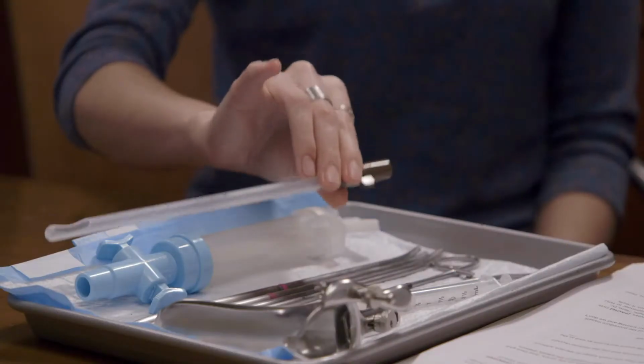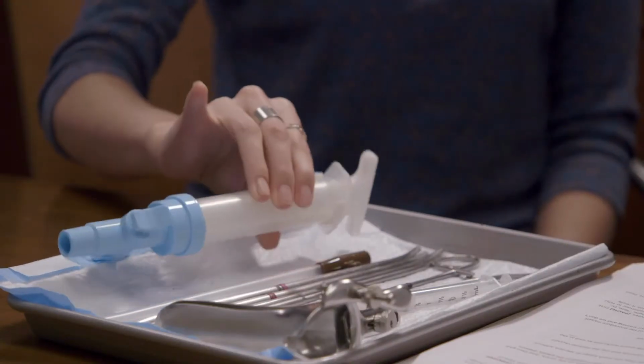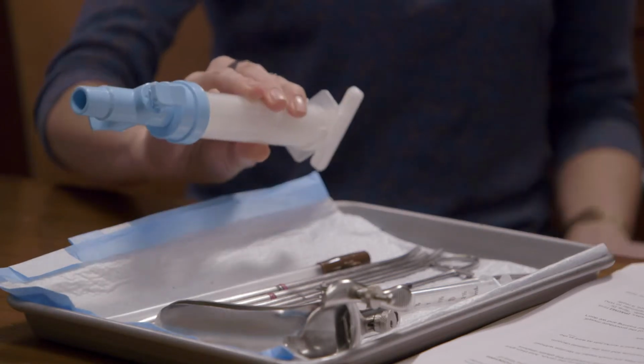And then I see we have the metal dilators here, not the plastic ones. Yeah, we've been using the metal ones here recently because they're easier to sterilize without melting. Got it. So then I'm going to dilate up to a size 25, and then I'll use this cannula, and then I'm going to use the manual vacuum aspirator to remove the pregnancy. Yes. I'm glad we reviewed this. It sounds like you have the steps of the procedure down really well.